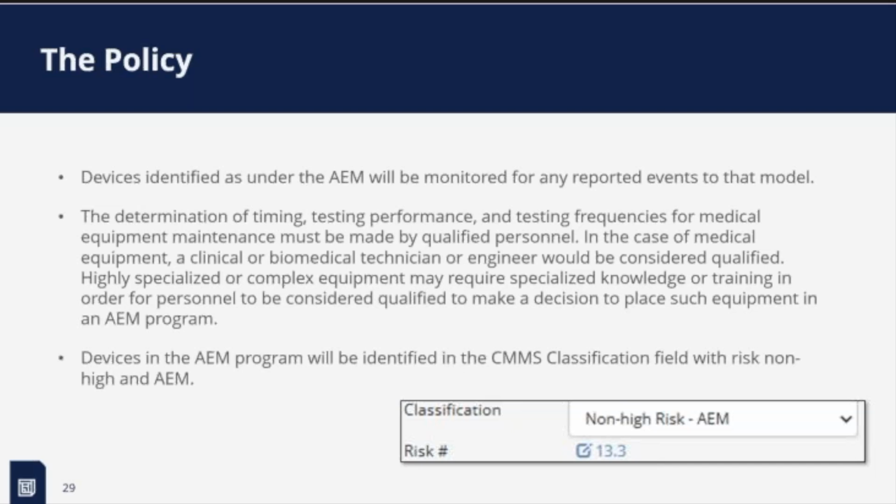So if you put your AEM policy in place 5 years ago and your documentation from 5 years ago, and you never did that analysis again to say, hey, this is working, can we tweak it again? So make sure you're documenting as you move forward too. So you're not done when you say, oh, we've put our policy in place and now we just do everything once a year and take the rest of the year off. I know you still need to document all that stuff.